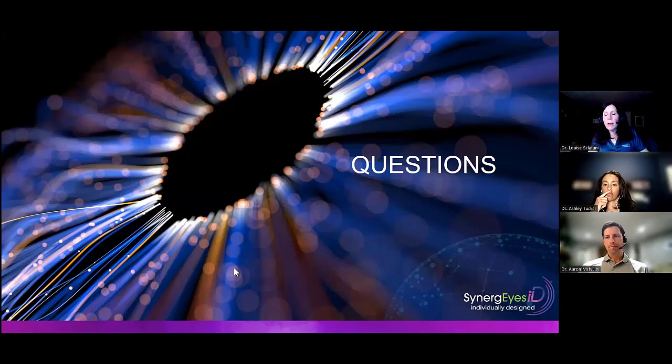In my opinion, correcting 6 diopters with this lens would be fantastic. Who else can do that? A soft toric lens is not going to give you that stability. It wiggles and you've got bad vision, right? Maybe a patient with too much cylinder needs to be switched into a scleral lens, a SynergEyes VS lens.